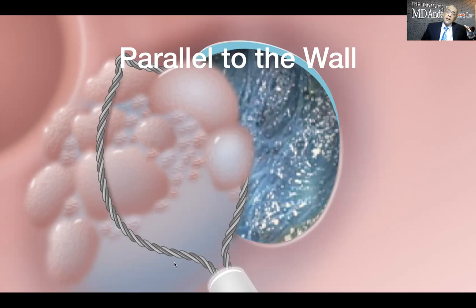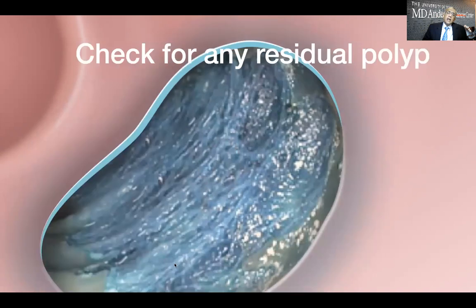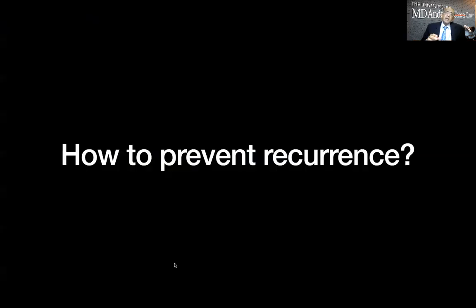After each cut, get into the habit of examining the base to make sure it doesn't show a perforation. And you anchor underneath the prior cut and then keep cutting until you completely cut the polyp. And once you cut it, you want to check for any residual polyp. That is really critical. If you don't see any residual polyp, you can do a few things to prevent the recurrence further from that microscopic disease at the edge.